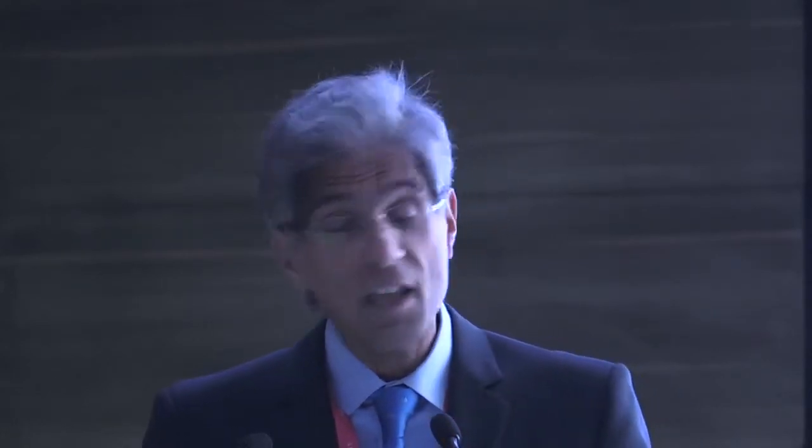On en face OCT and our utilization of this relatively new, innovative modality for the assessment and diagnosis of macular disease. So en face, Glenn very nicely, I think, summarized the methodology and the importance of en face OCT and segmenting the ellipsoid in MacTel. We'll give you a little bit more of a general overview of this modality. And essentially what we do, we take a high-density volume of cross-sectional B scans, and we reconstruct that very large volume of information onto a coronal or en face plane.